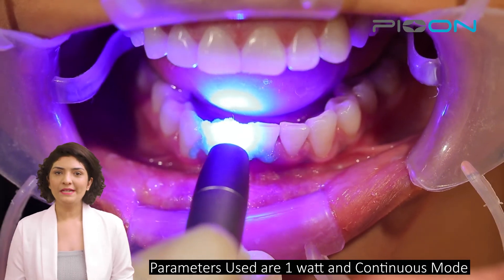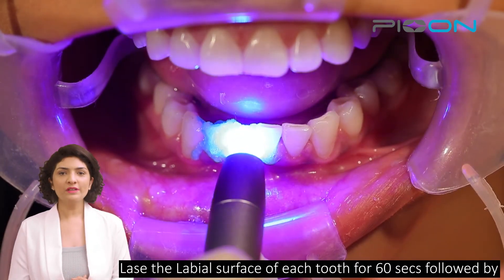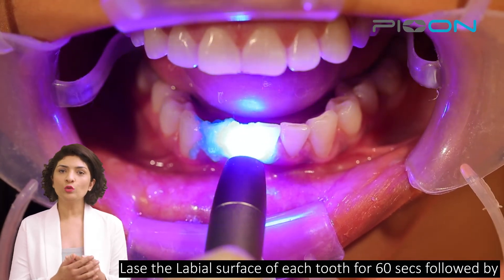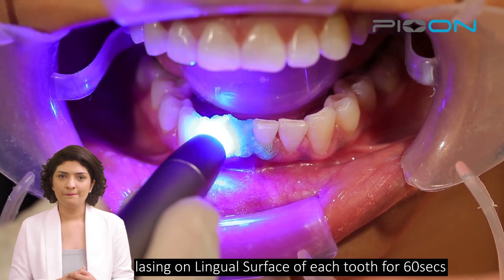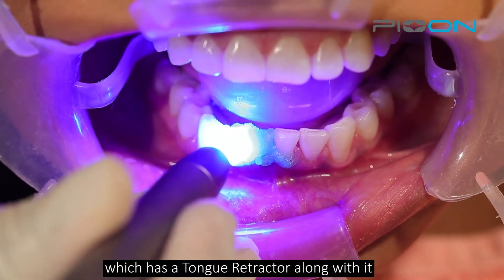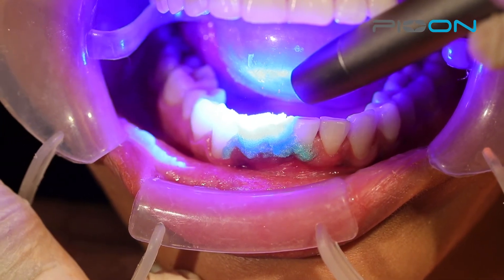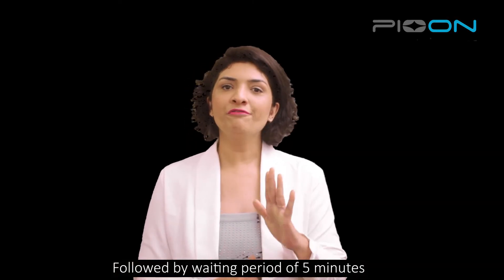We will do the teeth whitening procedures at the below mentioned settings. We will lase on the labial surface of each tooth for 60 seconds and on the lingual surface for 60 seconds, followed by a waiting period of 5 minutes.